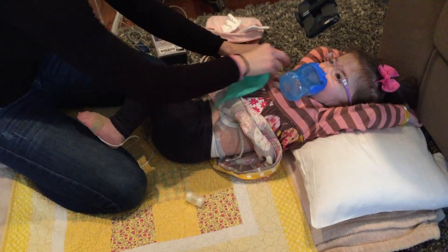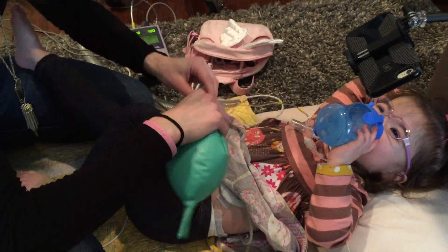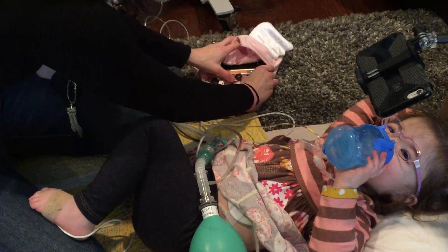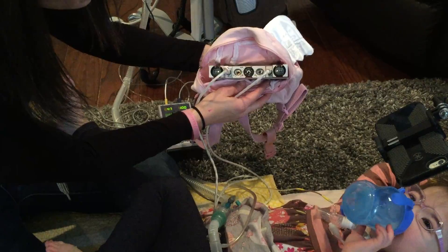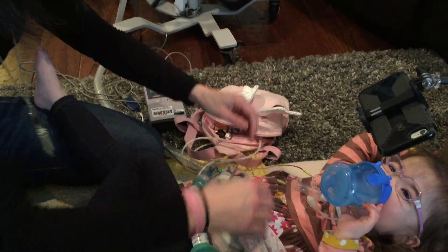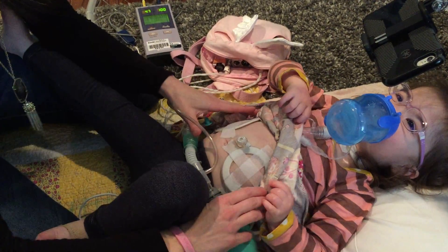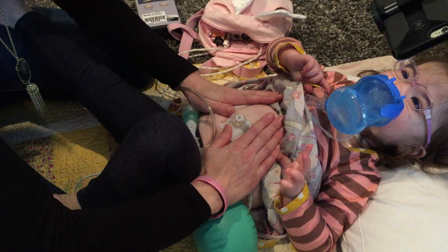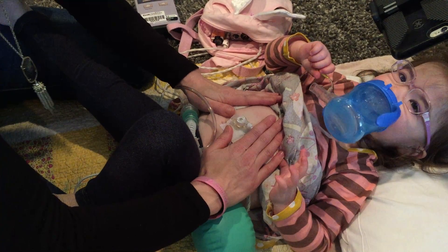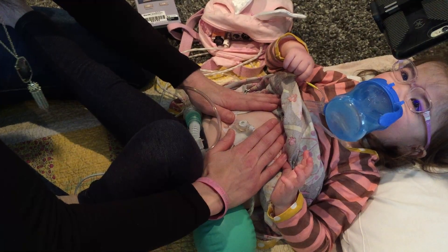Her HME — we just take it off. Turn them on — the two switches — and you can see the red buttons flashing, indicating that there is power. You can see her stomach kind of expand and contract. I put my hands on here so I can actually feel the electrical impulses, so I know both pacers are working — both the left and right side.